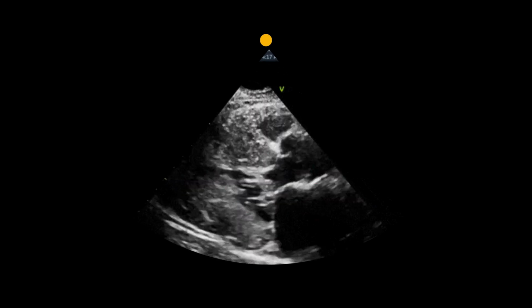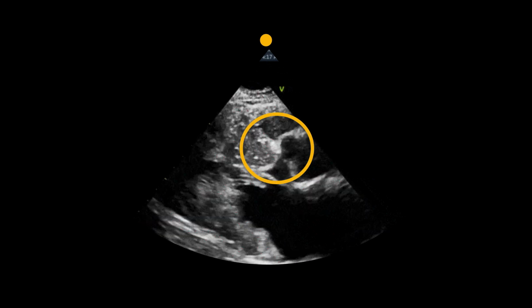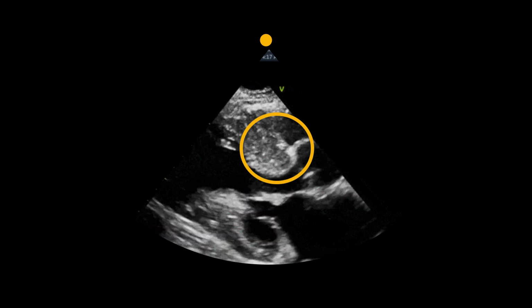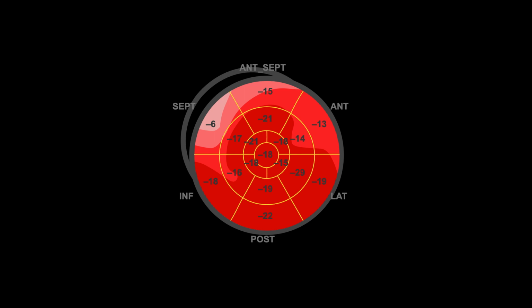For example, this patient has a basal septal bulge due to hypertrophy, which indicates early signs of ventricular remodeling and will affect the strain imaging data. Specifically, it can reduce strain near the basal and mid-left ventricle wall segments. The values will be less negative and closer to zero, which will also decrease the average GLS value.